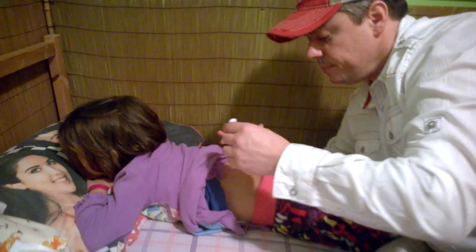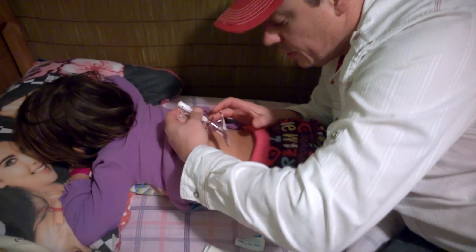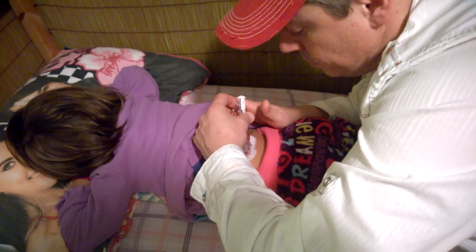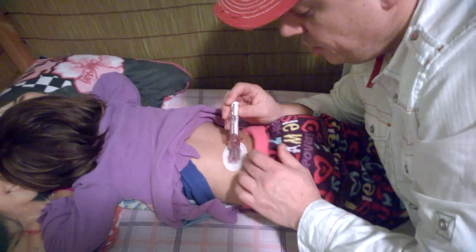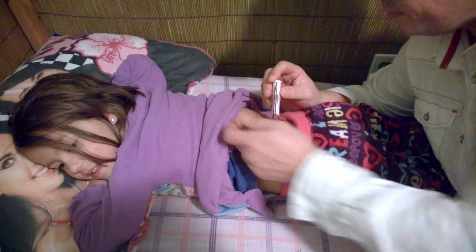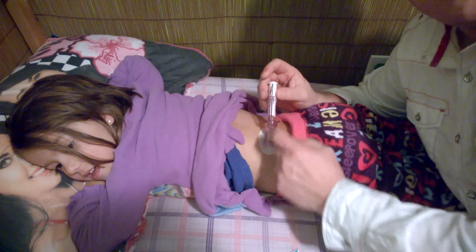Then we're going to find the spot we want to put it on. I can see the dry spot. And rub it down. You can see it sticks really well.